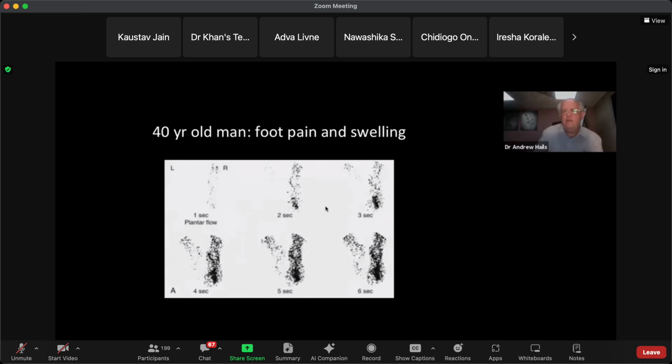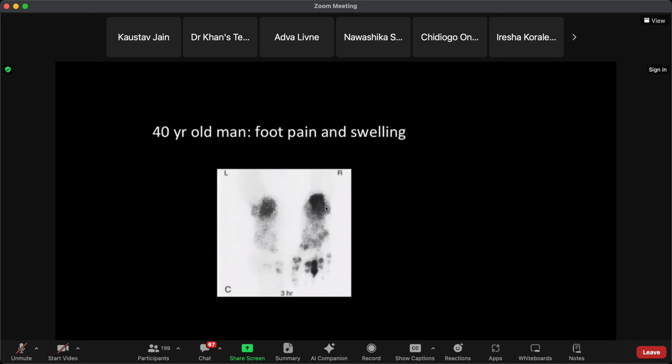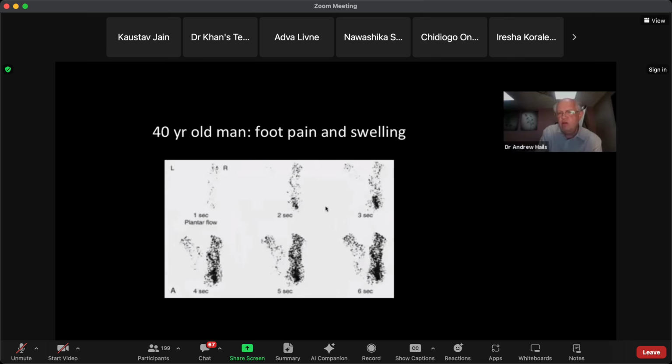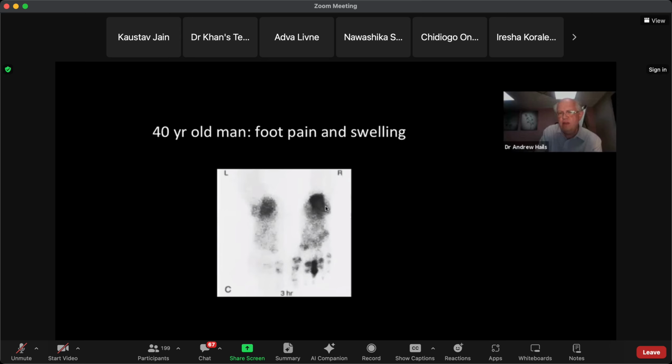Yes, and what kind of bone scan is this where you get the 3 sets of images? So it is a triple phase. Yes, that's right. Blood flow, blood pool, and delayed bone phase images. So yes, it may be an infection, mightn't it? It's osteomyelitis. I think that's quite possible.